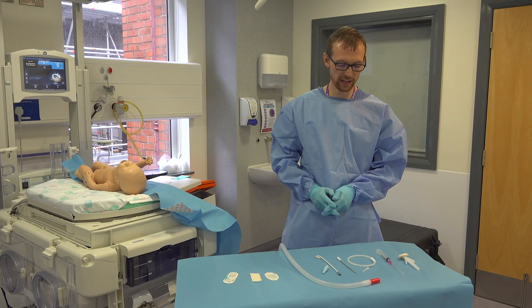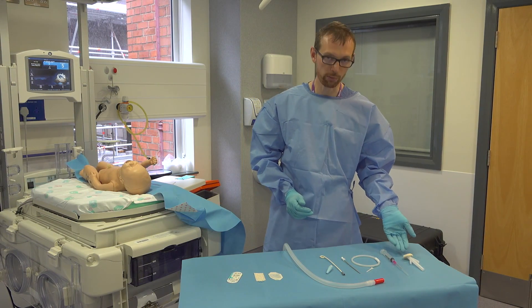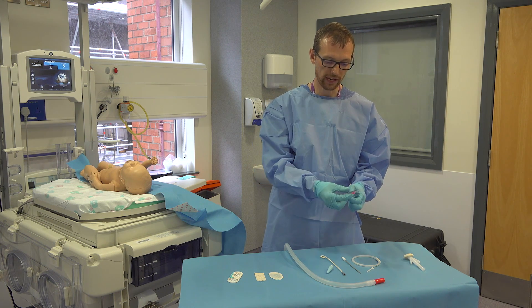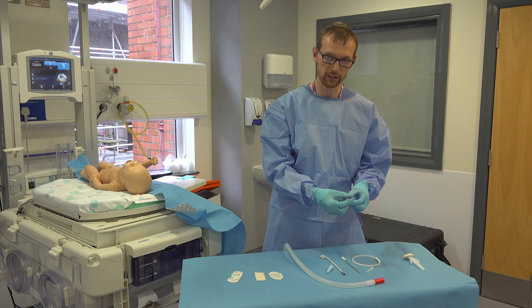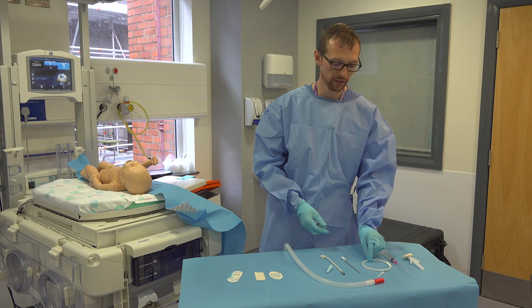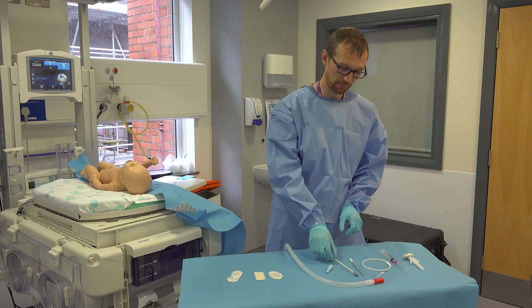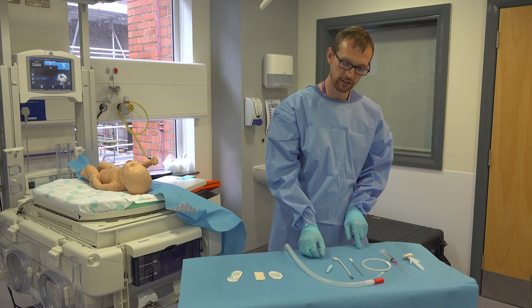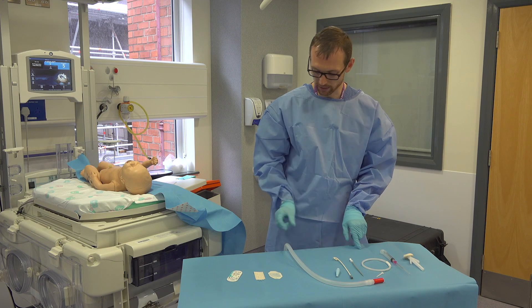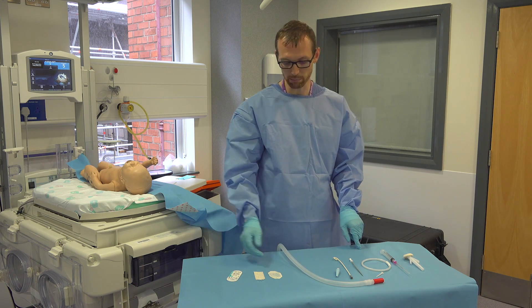As you can see, we have our sterile trolley set up, our appropriate cleaning fluid, a syringe with the needle on the end and secured. We have our guide wire, our dilator, and our pigtail chest tube with the spigot for the end. And pre-prepared earlier, the chest drain bottle.